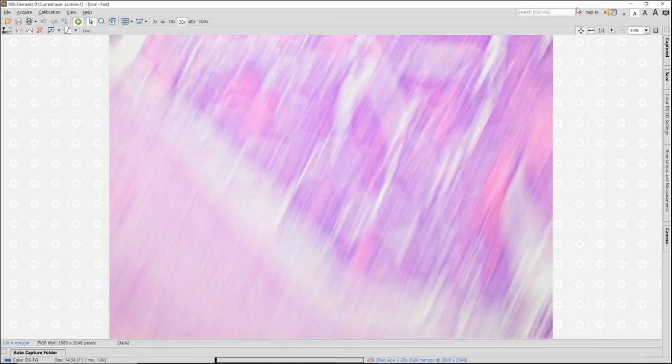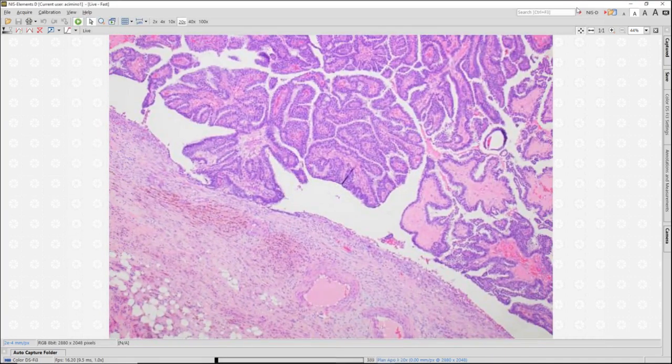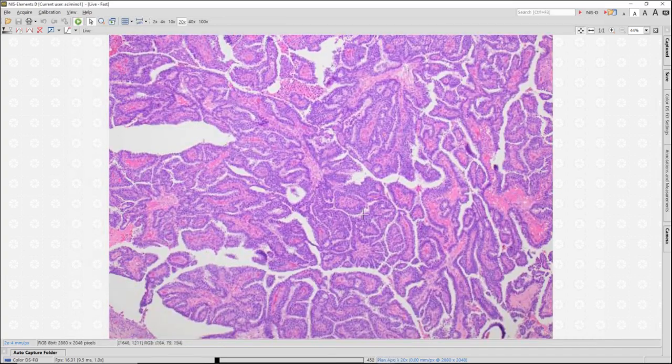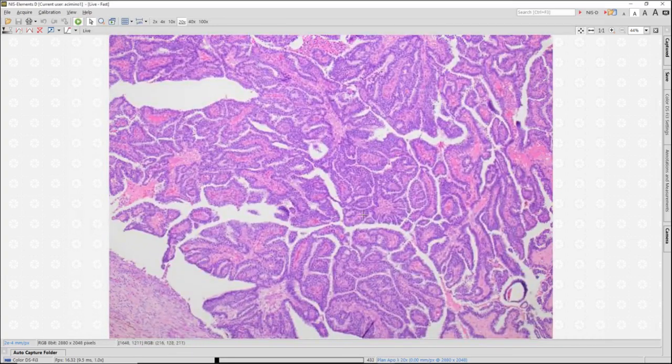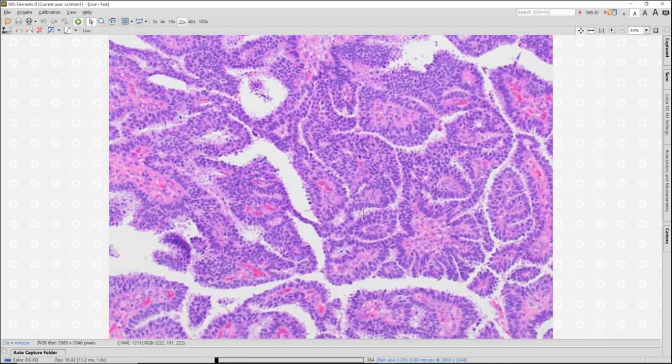Okay. So here I have a lesion, so let's decide what I have. I have a lesion that looks to be within a dilated duct space. I see this space, I see some lining, and then I see fibrovascular cores. I think I'm dealing with a papillary lesion. In contrast to the benign intraductal papilloma, this lesion, from low power, appears more blue than pink. I don't see the hyalinization of the stroma within the cores. I don't see broad-based fibrovascular cores or papillae.